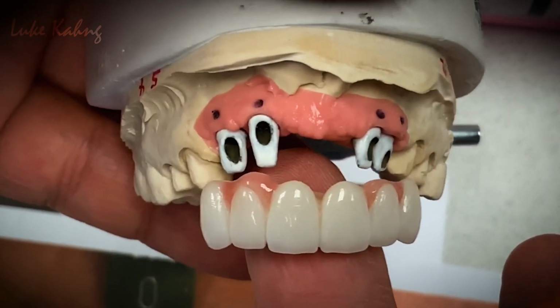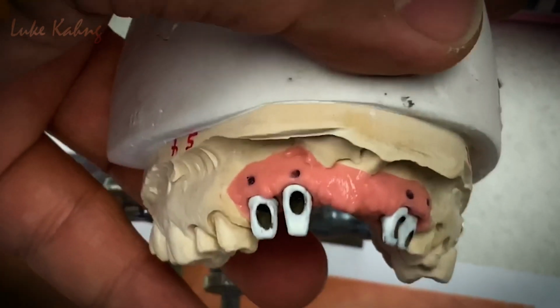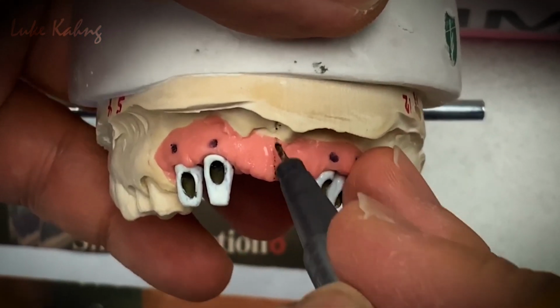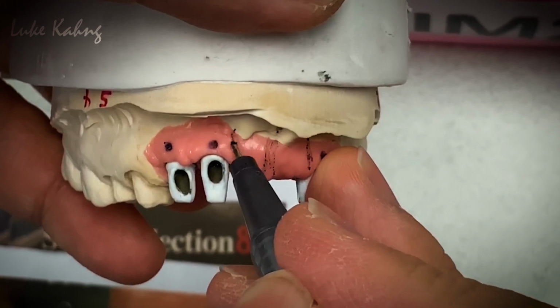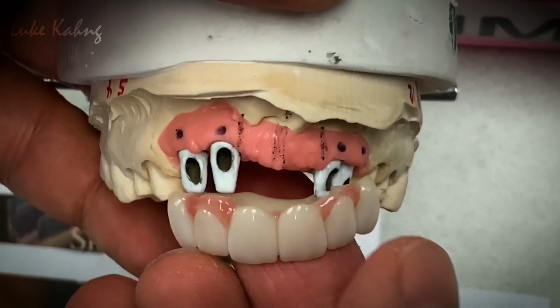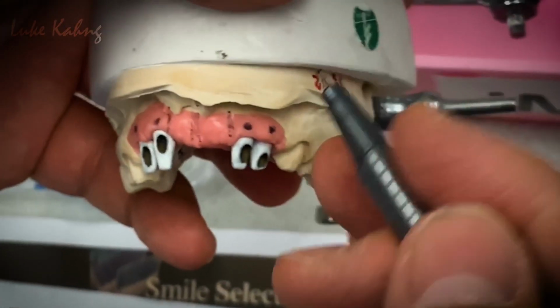This is about exactly what I'm talking about, the first video, the second video, but these are different cases, though identically the same. What I'm trying to say is we have to set the midline from here, okay? Once you set it up, then I see half of the size, which is limited, that we do have. So this and this are 8 and 9, a little bit bigger, just like this. Now the lateral, we have to move in that direction, this the other direction, so make it like this.